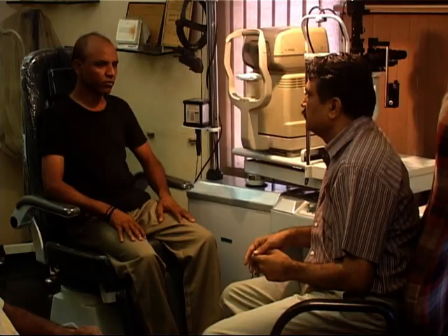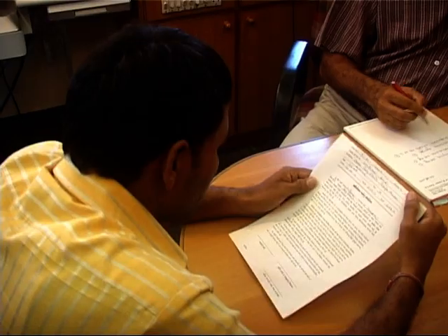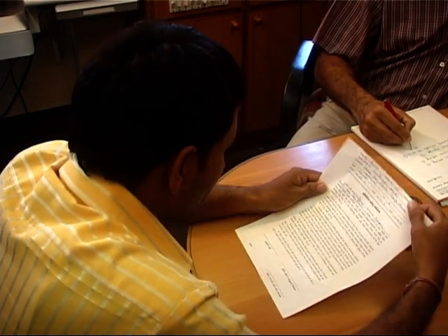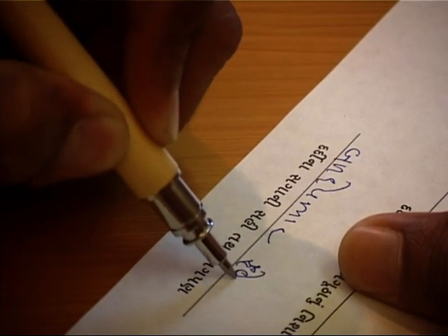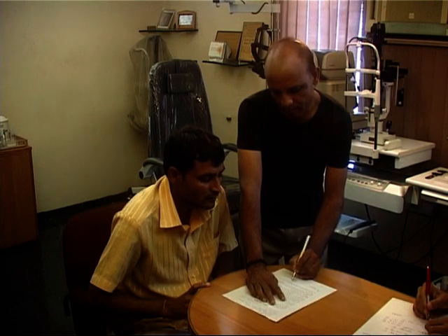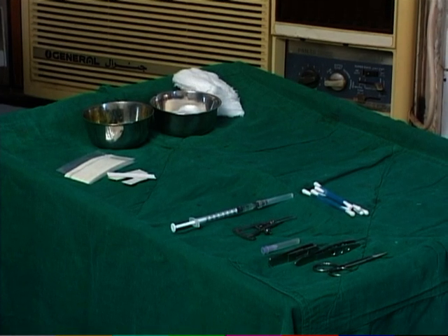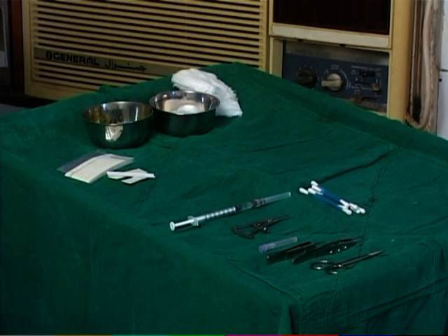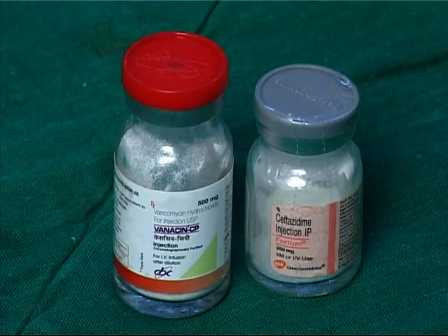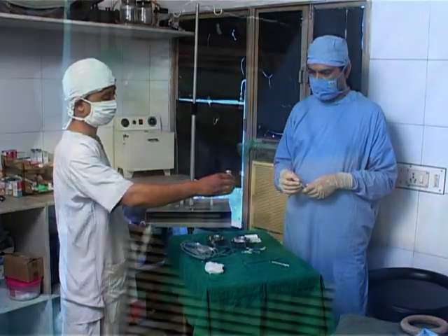Intravitreal injection should be given inside the operation theater after taking written informed consent, under all sterile and aseptic precautions, under topical, subconjunctival, or peribulbar anesthesia. Prepare a sterile trolley containing lid speculum, calipers, fixation forceps, sterile cotton-tipped applicators, eye drape, and pad. Prepare the required concentration of antibiotics in separate tuberculin syringes.